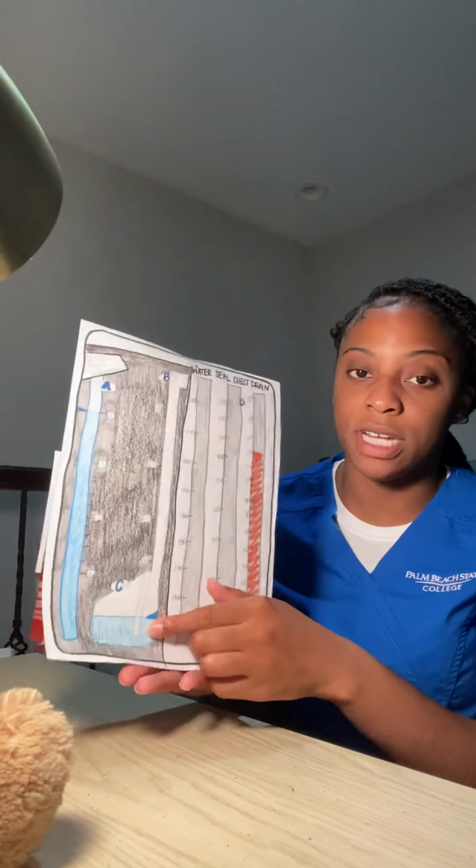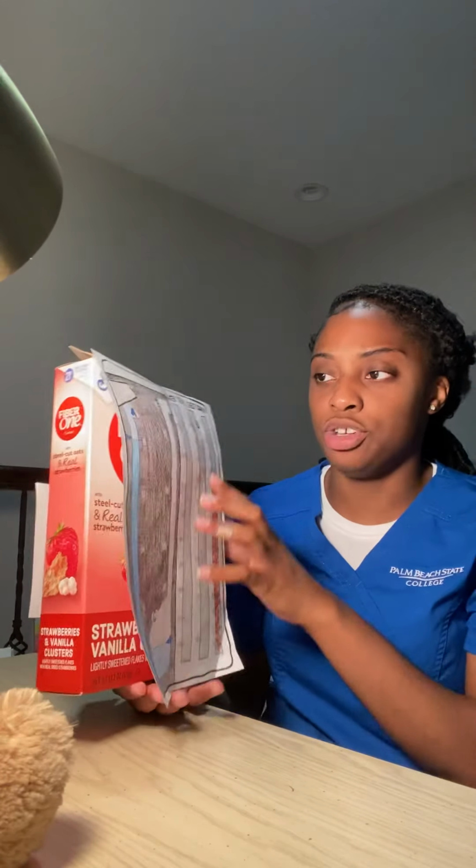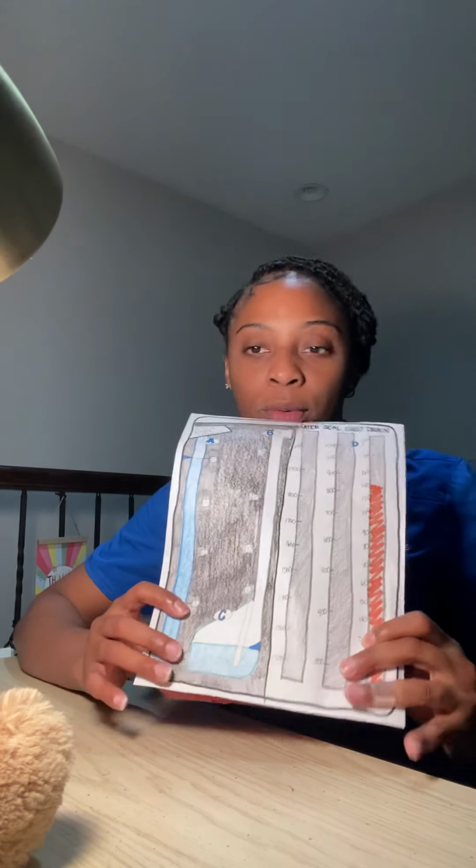I've checked my drainage. If I see in my air leak monitor down here that there's some bubbling, I can go ahead and check the tubing. I would use my clamp, and I would start closest to the patient's dressing site, and I would clamp it there just to see if the bubbling stopped. In my case, I have no bubbling in my air leak monitor, so I wouldn't need to do that.